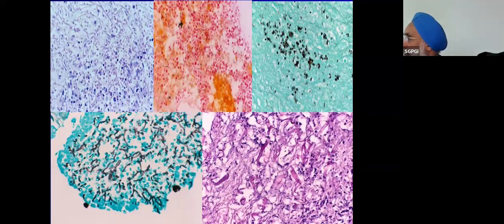And as I mentioned earlier, the pathologist can sometimes give these diagnoses within 6 hours of the biopsy, whereas a culture may not even come positive if the fungus is dead, or it may take 3 or 4 weeks before you get the result.